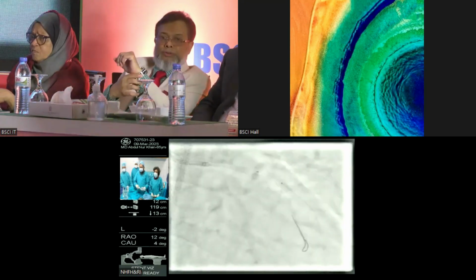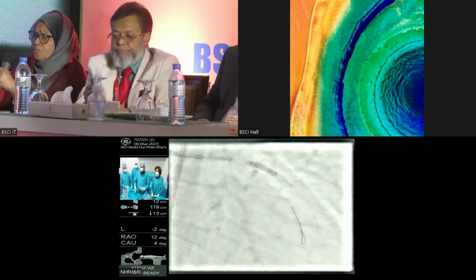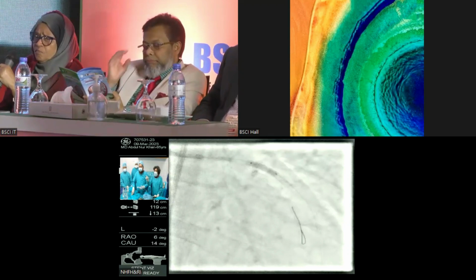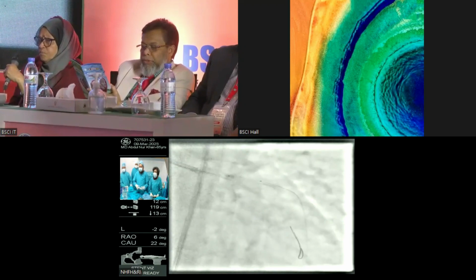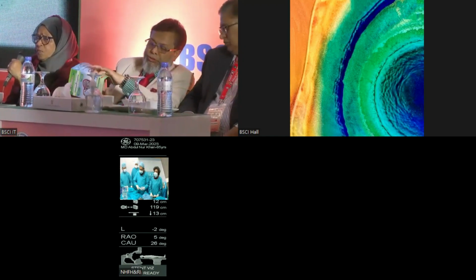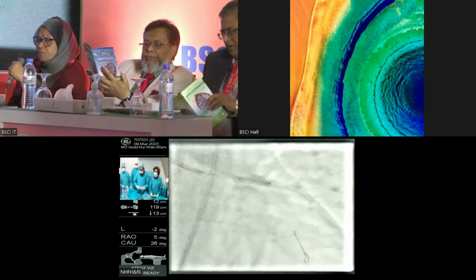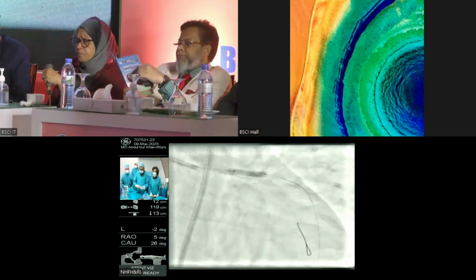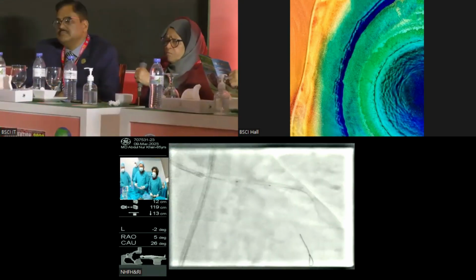So we're doing post dilatation of our stent. Do you plan to do a DCB for the side branch in this case? That's a great suggestion, and maybe we can do that, and let's see how things evolve. That would be something good to do, because then we don't have too much metal mass in the carina. And as this is not that big a vessel, maybe we can get away with doing a DCB, even though the Medina is 1,1,1.